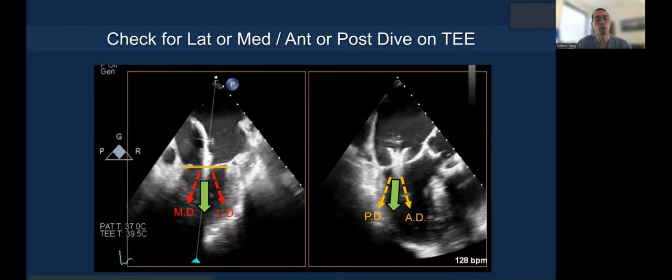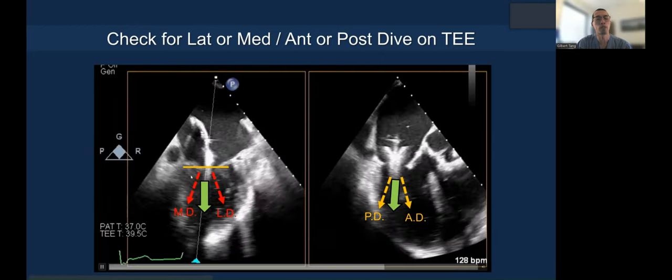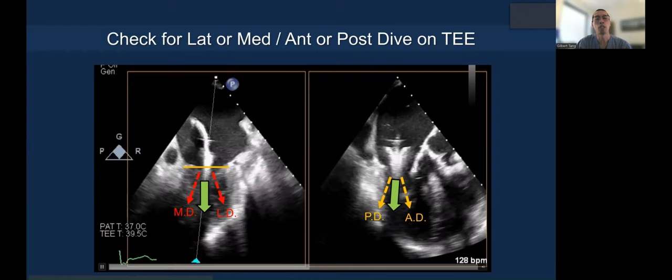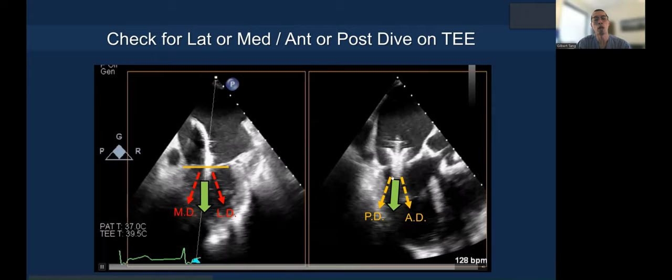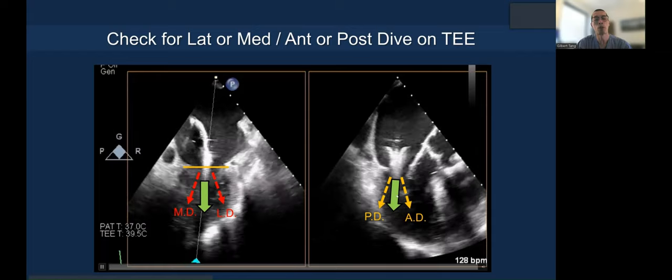To give another perspective: this is the end-on plane, straight down perpendicular to the annular plane — you don't want a medial or lateral dive. And on the X-plane grasping view, you want to go along the area of grasping — you don't want an anterior or posterior dive.